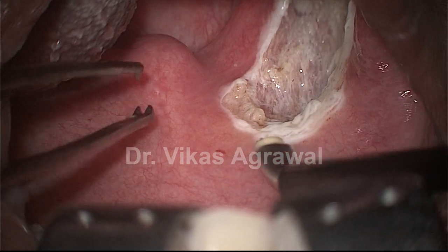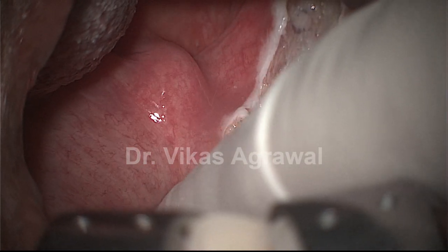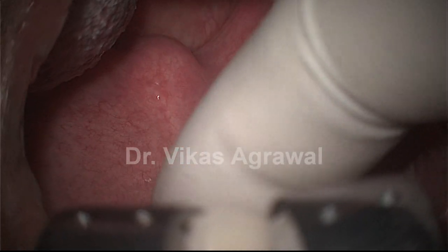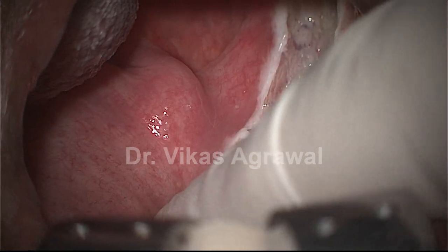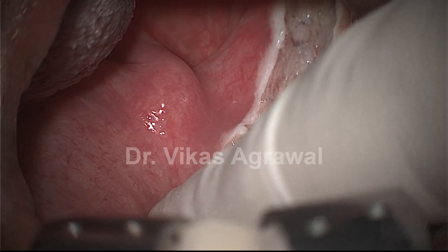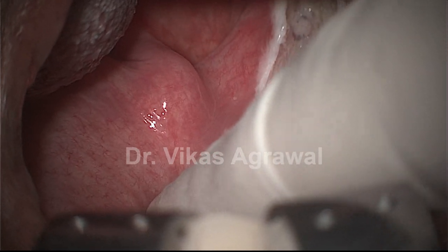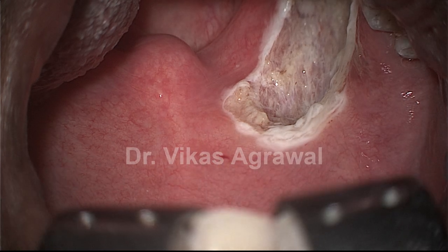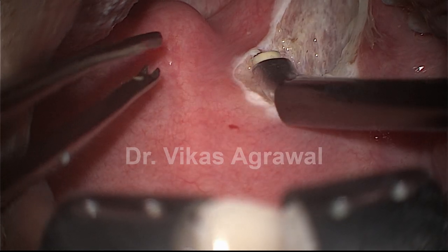I have done the tonsillectomy on the right side. He has got a high palatal collapse, and as you can see here, this is the hard palate and the distance behind the hard palate is not great and his soft palate is pretty long. You can see my finger is going and touching at this point but this point is always above the line joining the anterior pillar to anterior pillar.